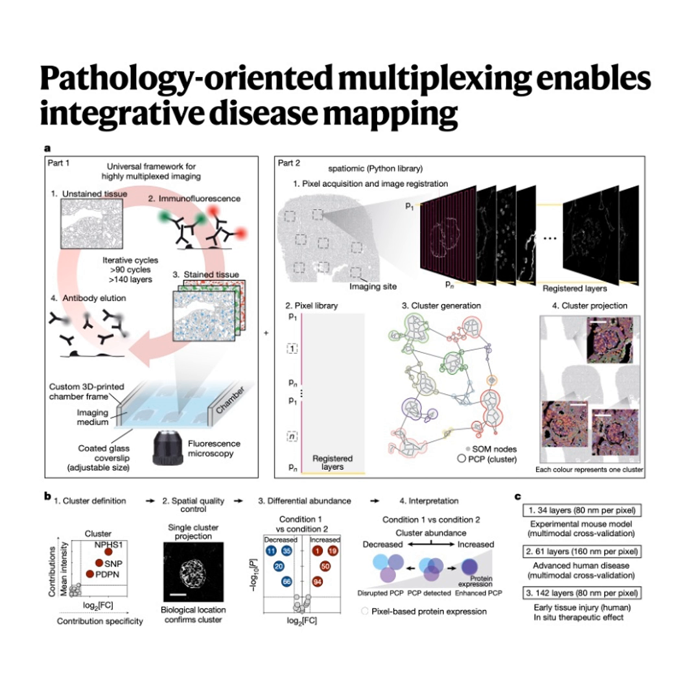Yes, and this is really important for clinical relevance. They linked the abundance of these PathoPlex-derived clusters directly to the patient's estimated glomerular filtration rate, or eGFR, which is the standard clinical measure of kidney function. And what did they find? They found strong correlations. For instance, another cluster, cluster 28, which represented signatures of extracellular matrix, or ECM, remodeling, basically early scarring.